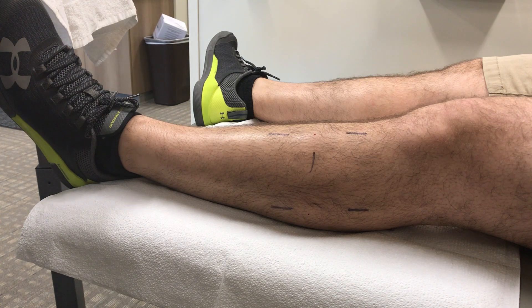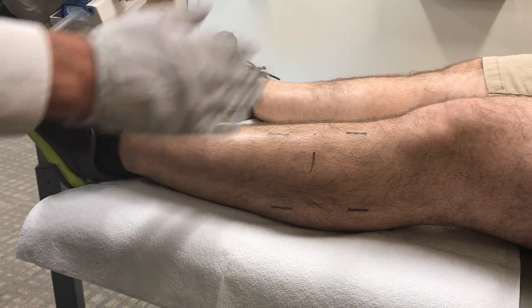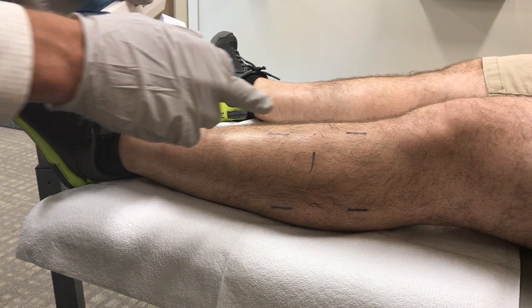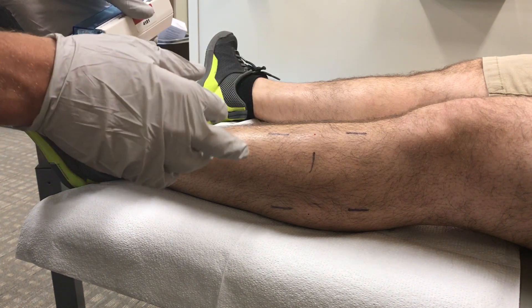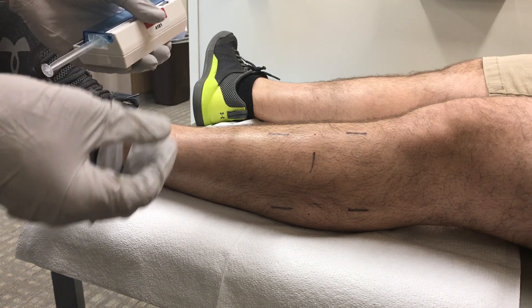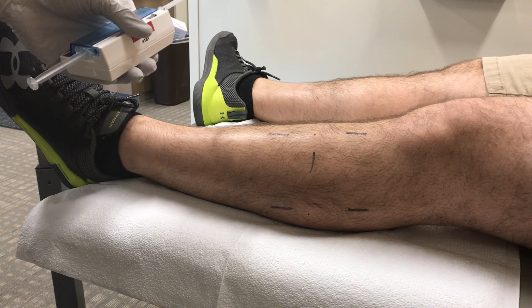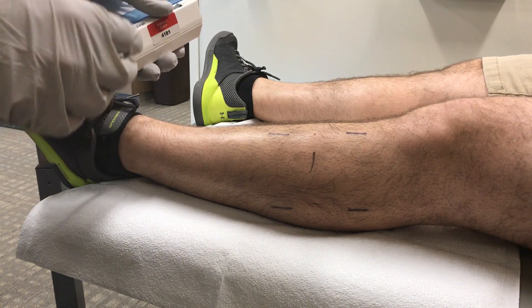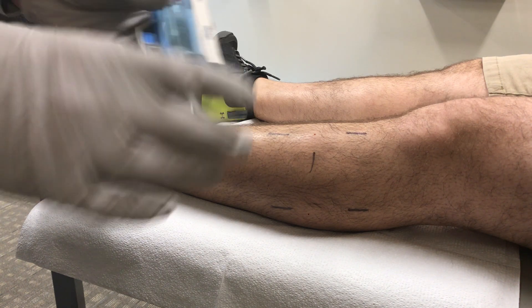I've already marked him and cleaned the area with alcohol to keep it sterile, then placed lidocaine just subcutaneously. You don't want to inject lidocaine too deep or you can get into the compartments and alter the test results.